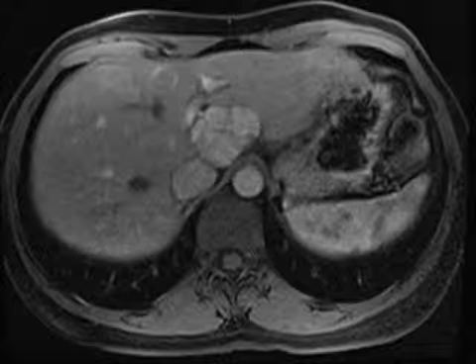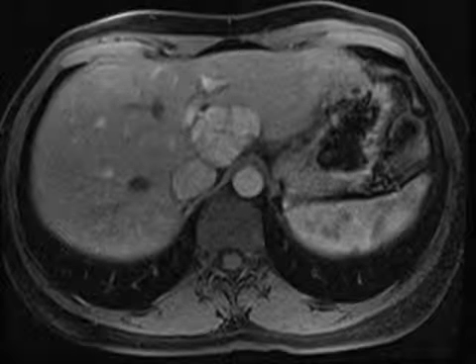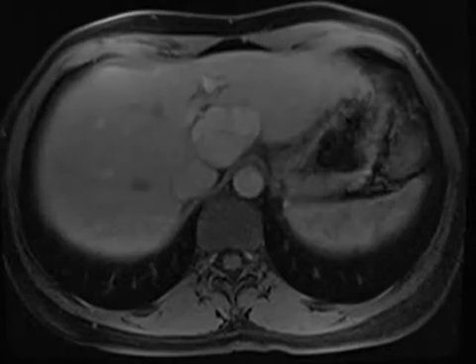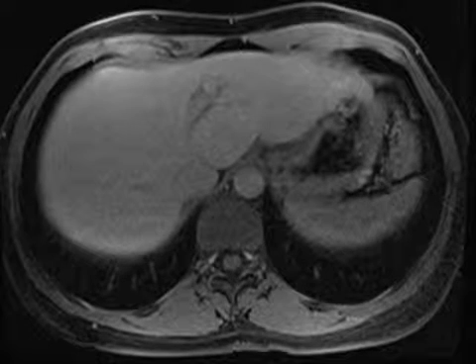Notice on these MR images that the mass is iso-intense to perhaps minimally hyper-intense on T2-weighted images. On T1, it is subtly hypo-intense. It does show some restricted diffusion. It's showing avid homogeneous hypervascularity in the arterial phase, and looks relatively iso-intense on venous and delayed phase.